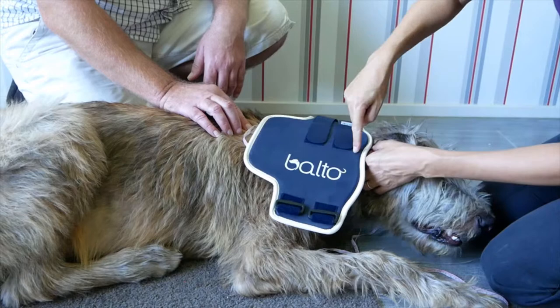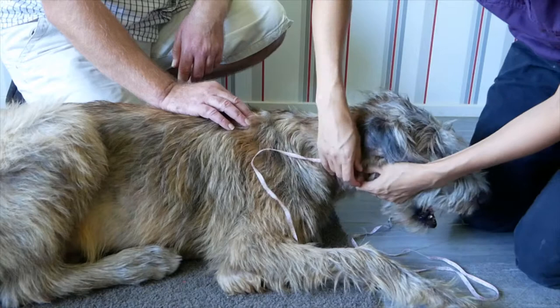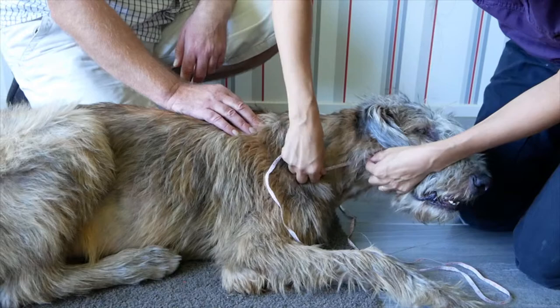The next step is to measure the ventral length of your dog from under the chin to the chest. It is the short length of the brace, referred to as distance C.